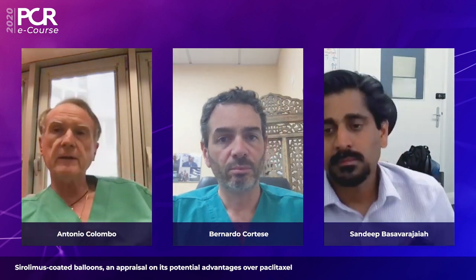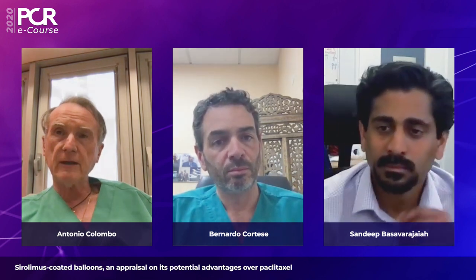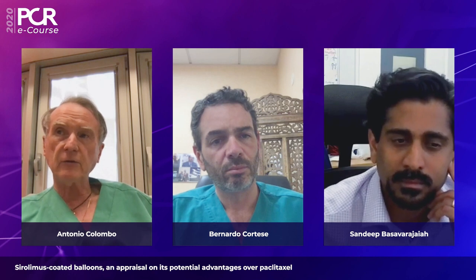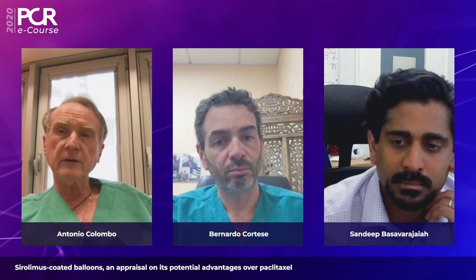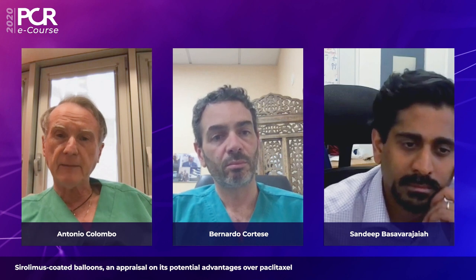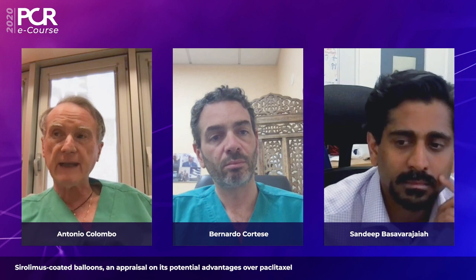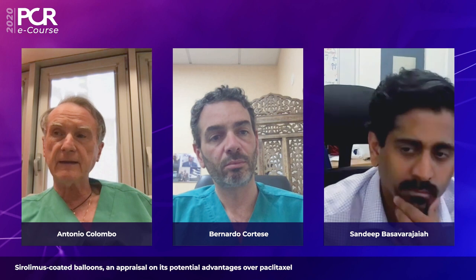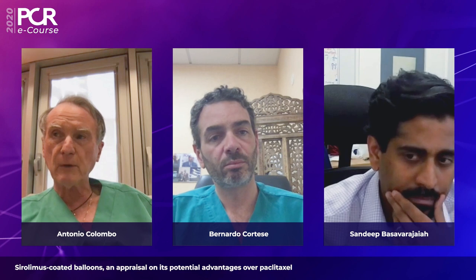Yes, absolutely, Bernardo. We have seen the usage of drug-coated balloon in native vessels and not necessarily small vessels. As a matter of fact, it is not rare that we implant a short stent in the proximal segment of the lesion, and instead of using a very long stent, we treat the rest of the lesion of the vessel with a long drug-coated balloon.